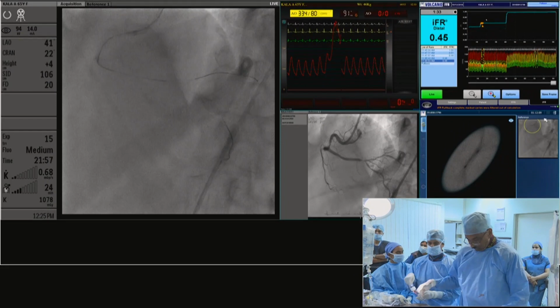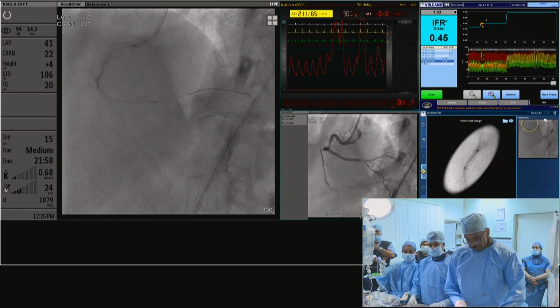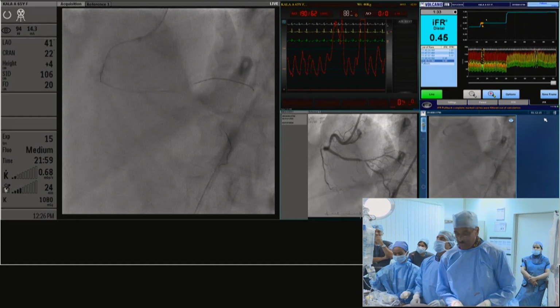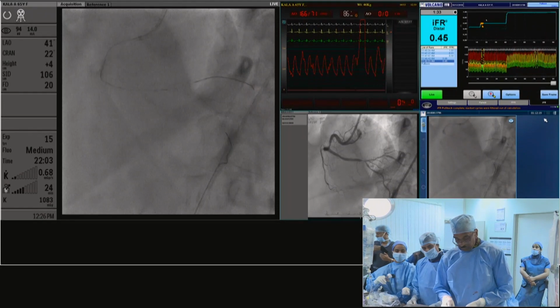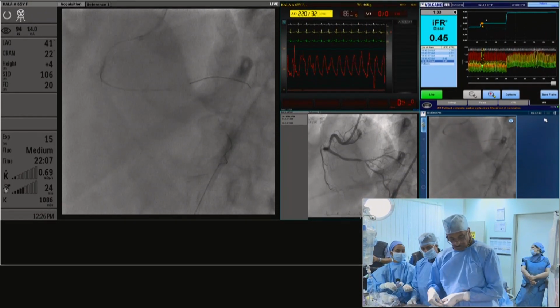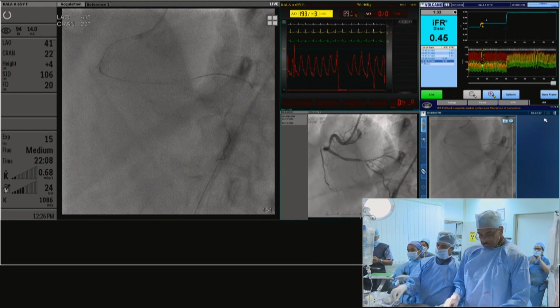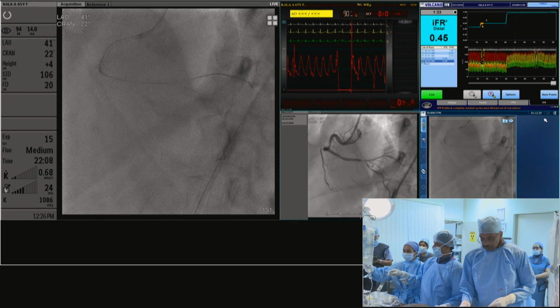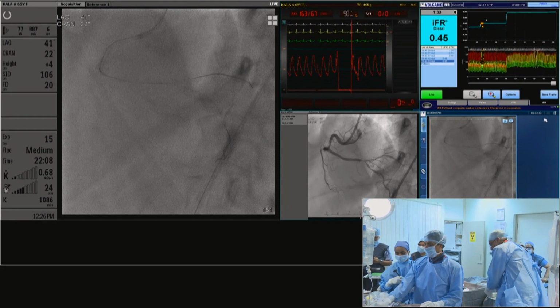We already dilated that segment with it. No, I'm saying it was dilated because of the inability to get equipment down. That too, the dilatation was done with a 2 millimeter balloon, which is definitely small. Once we have dilated it, it then seems reasonable to go the full way rather than dilate a lesion just to get devices down and then not do anything about it.